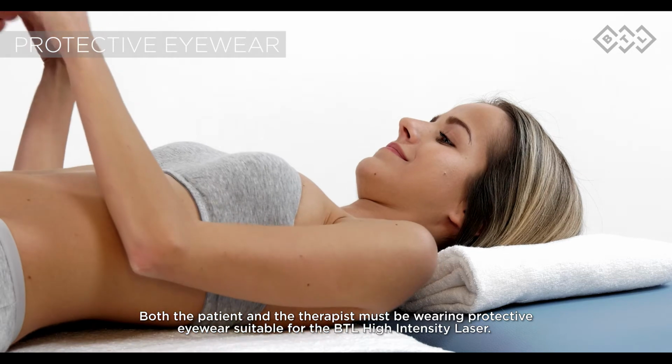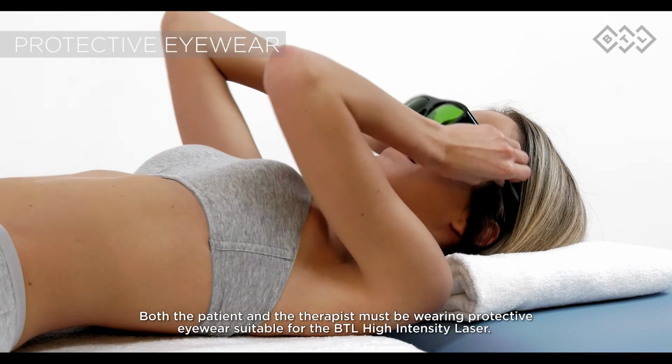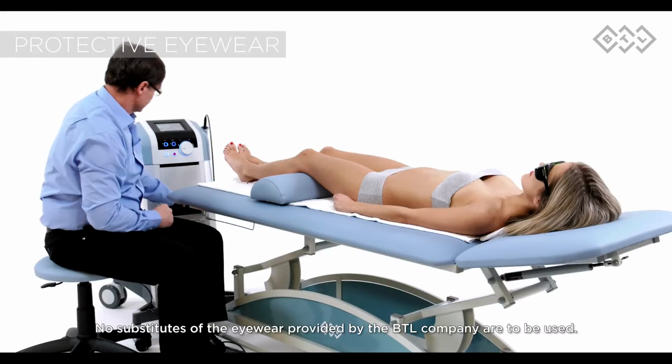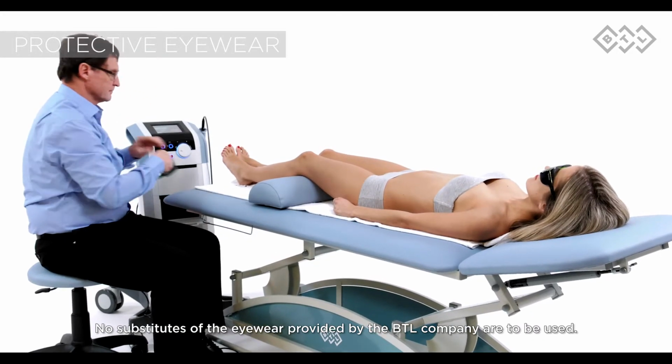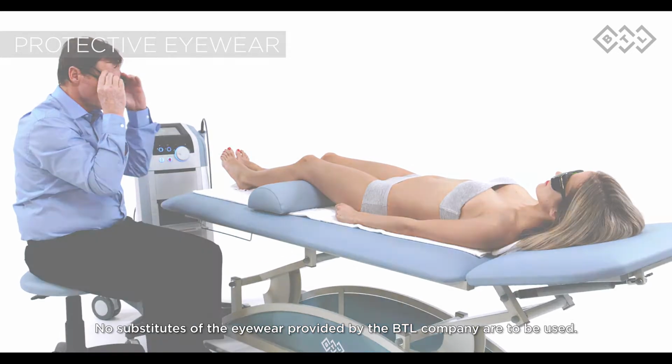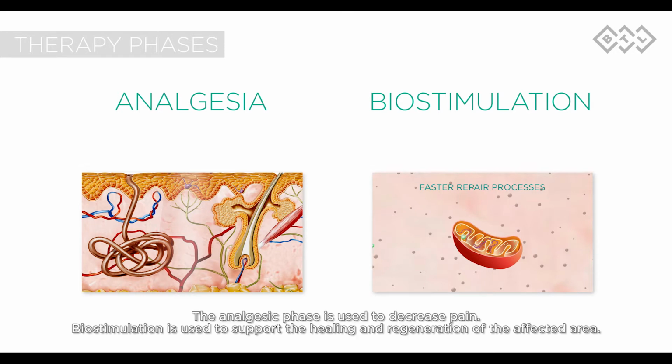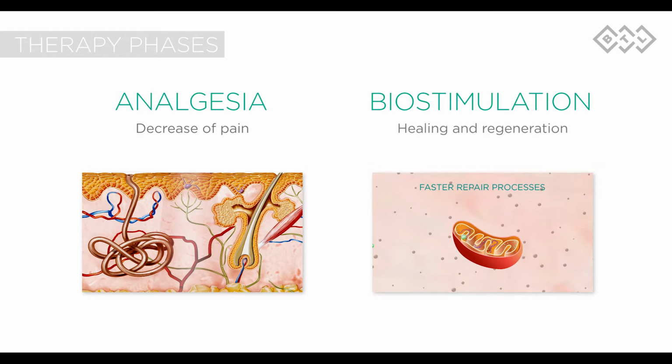Both the patient and the therapist must be wearing protective eyewear suitable for the BTL high-intensity laser. No substitutes of the eyewear provided by the BTL company are to be used. The therapy is performed in 2 phases, analgesic and biostimulation. The analgesic phase is used to decrease pain. Biostimulation is used to support the healing and regeneration of the affected area.